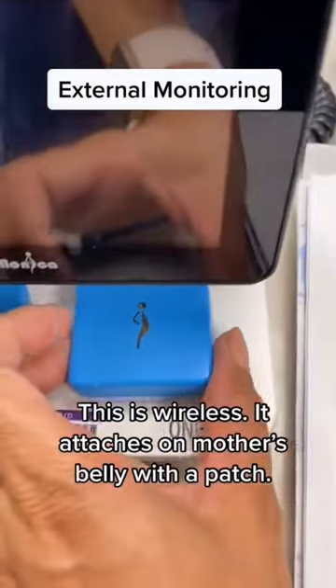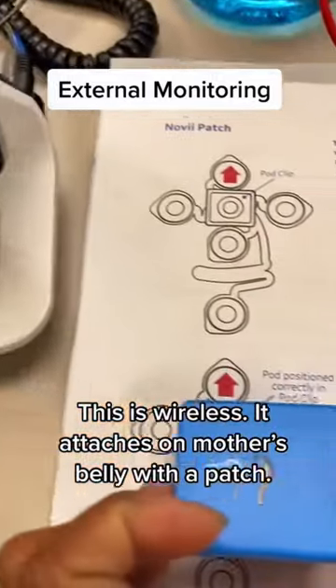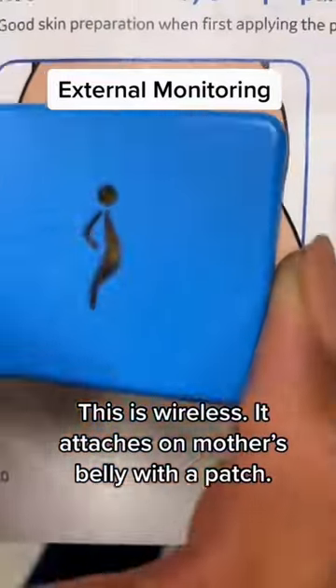There's another external device that is wireless. It is attached to a patch. This allows for more mobility and the mother can even get in the shower.